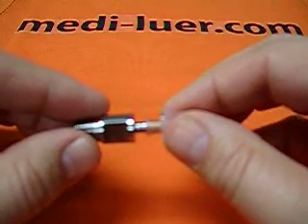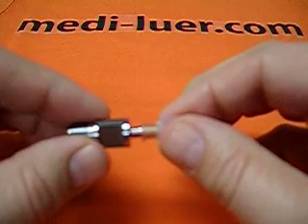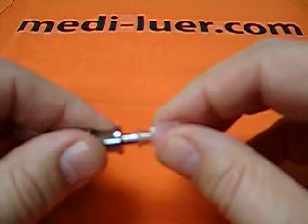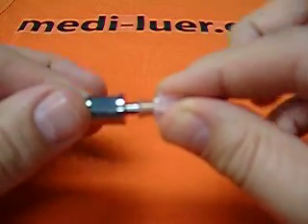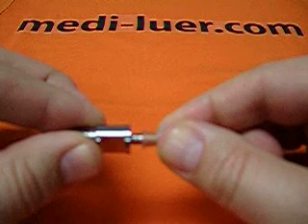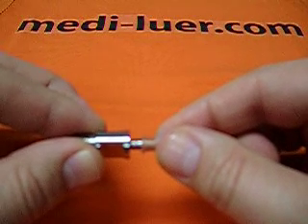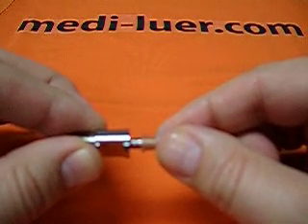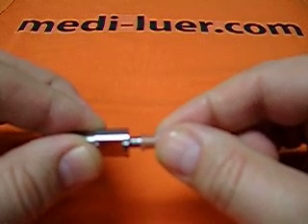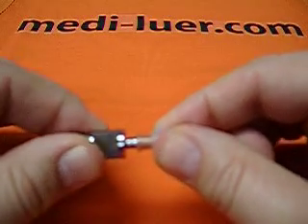The standard says not more than 27.5 newtons of force, not more than 0.1 newton meter of torque, both applied at the same time, and not more than a 90 degree rotation. If you put more pressure on, or you put more torque on, or you don't do them at the same time, or you exceed 90 degrees, you're going to invalidate your test.